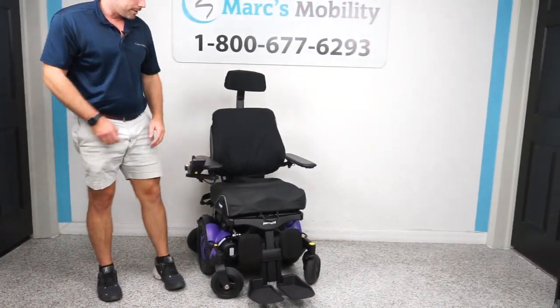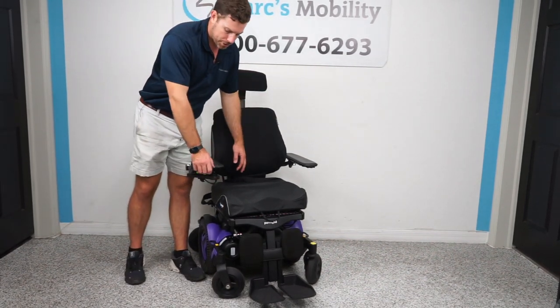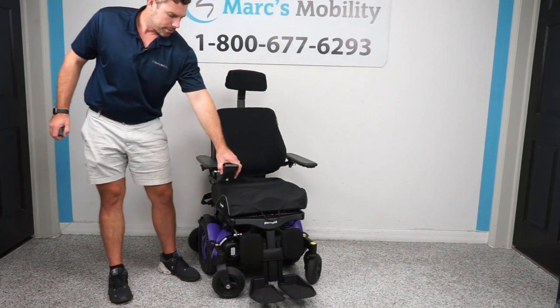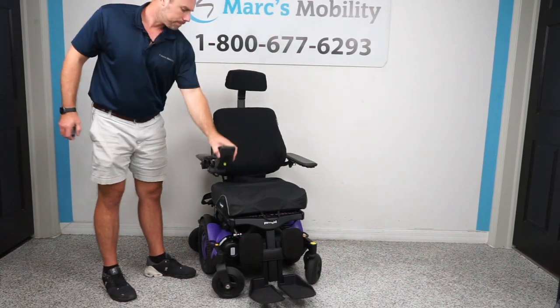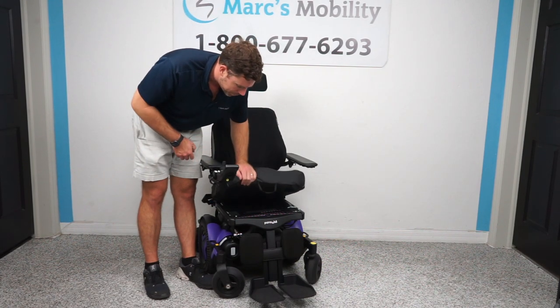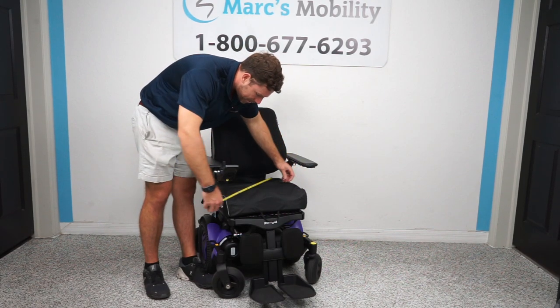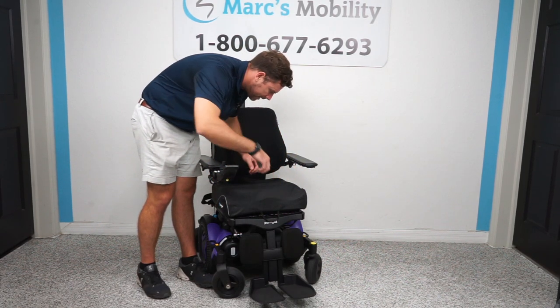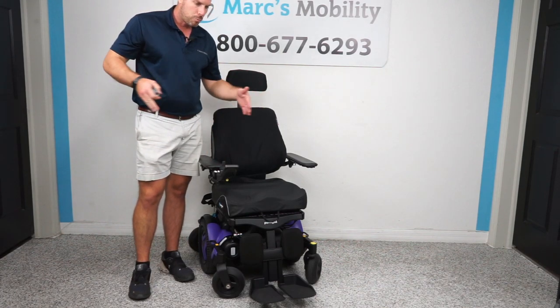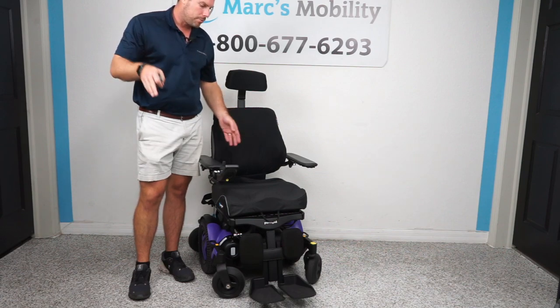This unit comes with a swing-away joystick so you can pull up to a table, or if you need help getting out of the chair and don't want to break your joystick, you can swing it to the side and push off on the armrests. Both armrests do flip up. This unit sits on a metal pan, so you can put any cushion you want on here. The current configuration is about 19 inches wide by 17 inches deep, but we can go anywhere from 17 to 23 inches wide and 15 to 22 inches in depth.